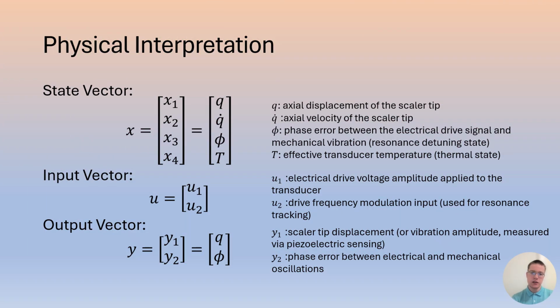Here you can see the state vector, input vector, and output vector, with each of the states, inputs, and outputs defined here.